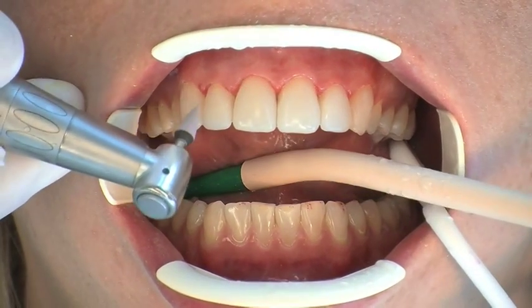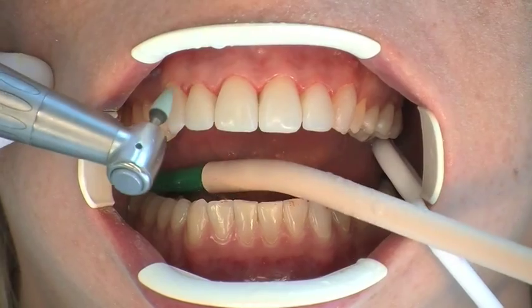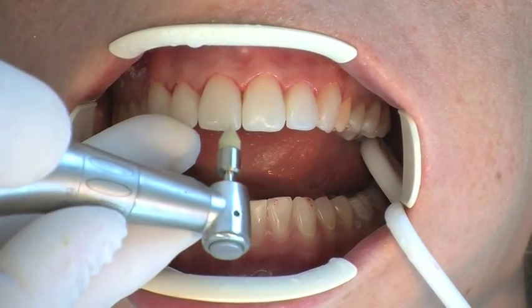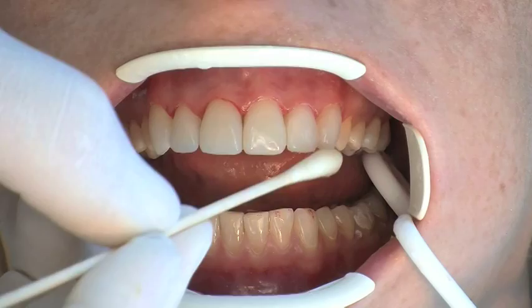Tapered polishers are used to accentuate mamelons or to smooth out structures. Silicone carbide-coated high-RPM brushes operating in a dry environment with air cooling are the best means of achieving an optimum high gloss.